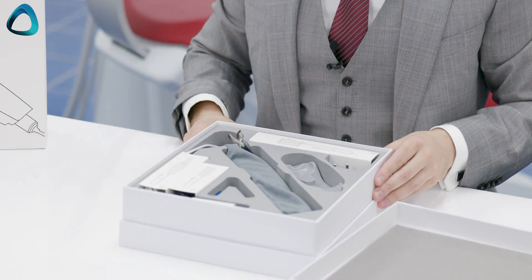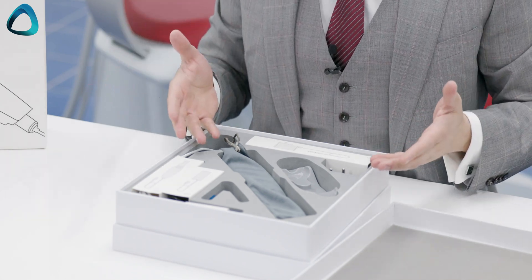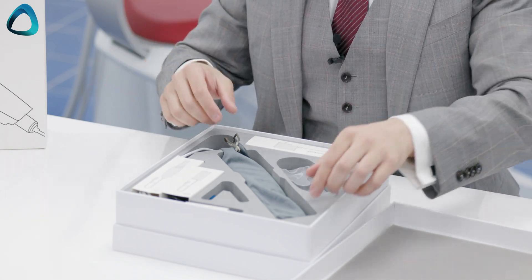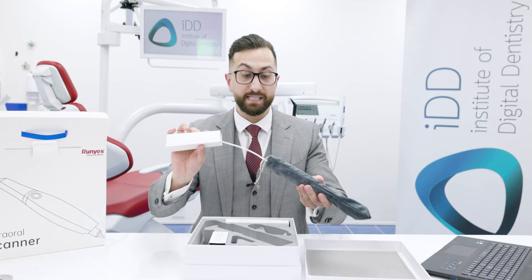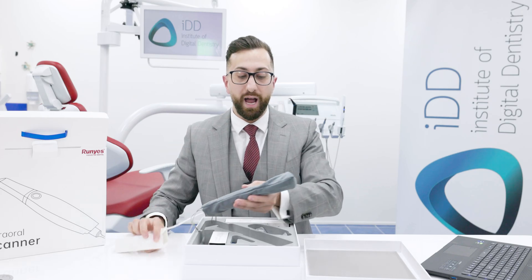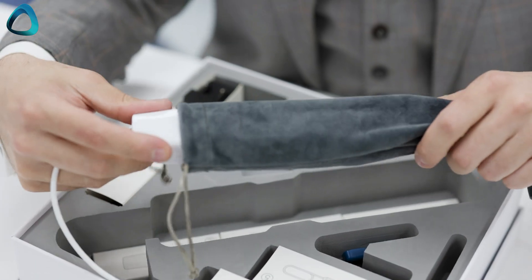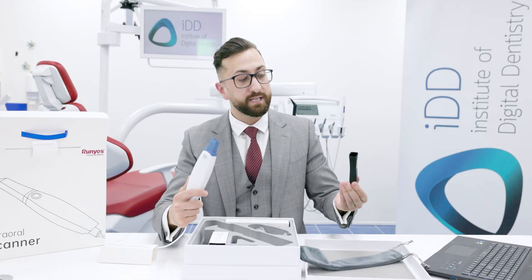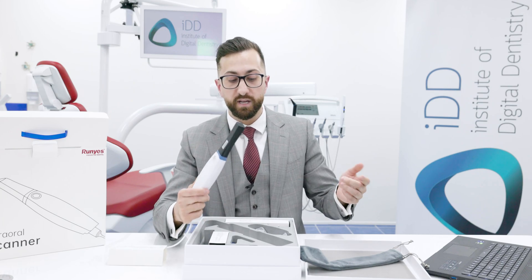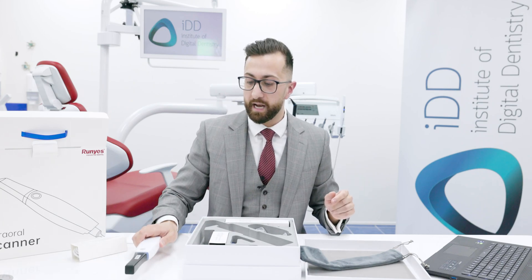As we open the box, this is what we're greeted with — everything that you get with the scanner. Here we have the scanner itself. As we can see there is a wire, so it is not a wireless scanner, and it comes in a little pouch with a protective covering. Pretty simple and quite common in the scanner market.